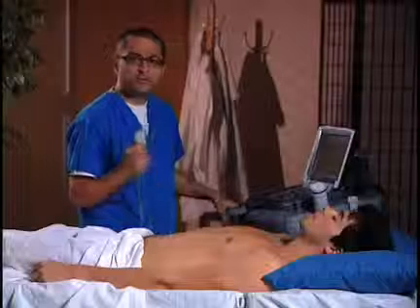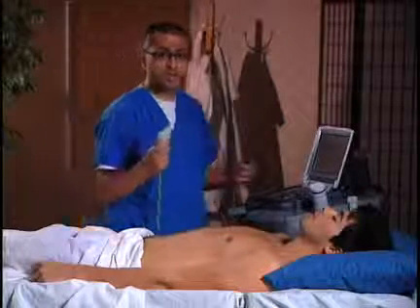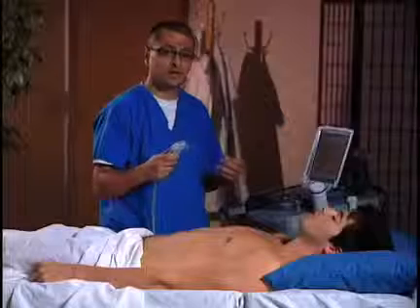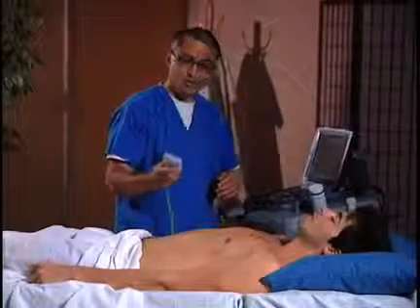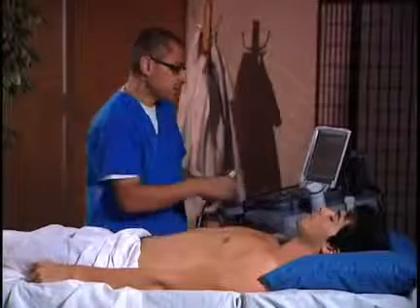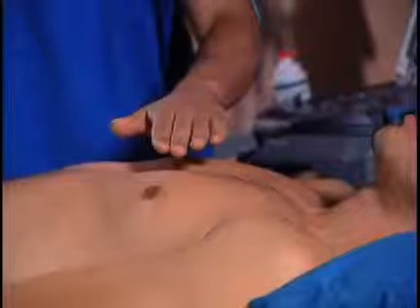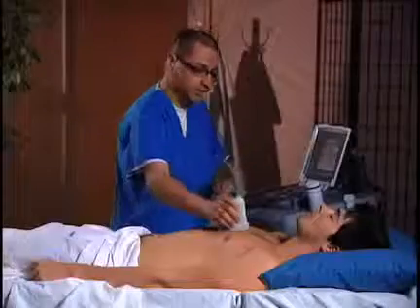If you have time, you want to use your linear array transducer. This transducer does high frequency imaging and allows you to do much better imaging of superficial structures. So we're going to get a lot better quality, high resolution pictures of the pleural line. So here's the transducer that I've chosen. This is the marker here right now, and I'm going to go ahead and put a little gel here. Now I'm going to cut sagittally at the highest point in his chest, in about the mid-clavicular line.